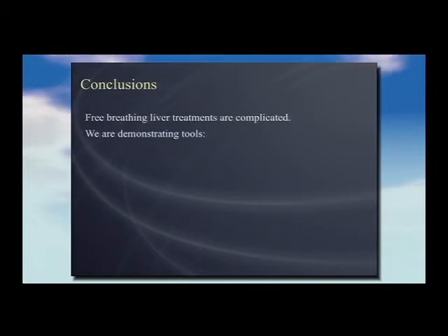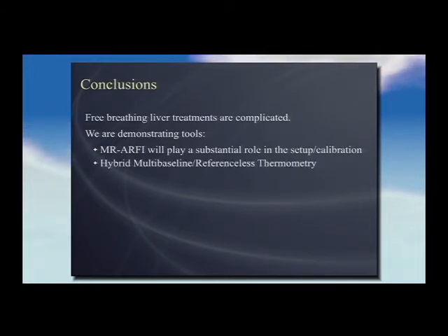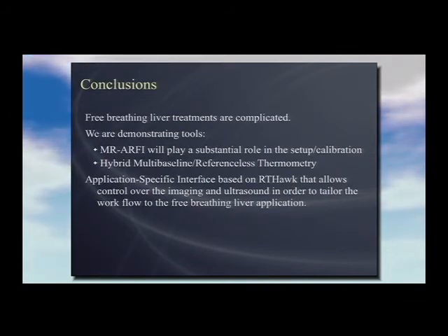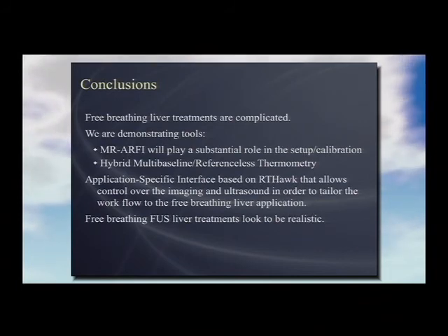We're demonstrating some tools, in particular the MR-ARFI, which we think will play a substantial role in the setup and calibration of free-breathing procedures in the liver. We also think the hybrid multi-baseline referenceless thermometry is very, very important, and unfortunately I didn't have the time to go into too many details on that. So we're building an application-specific interface based on the real-time imaging that allows us to give control over the imaging and the ultrasound in order to tailor the workflow to the free-breathing liver application. And just lastly, we believe that free-breathing focused ultrasound liver treatments do look to be realistic.